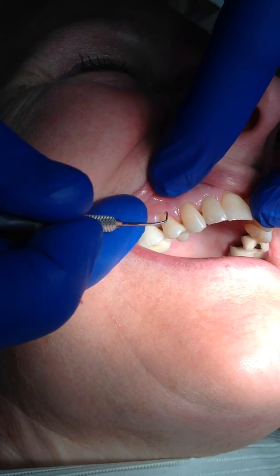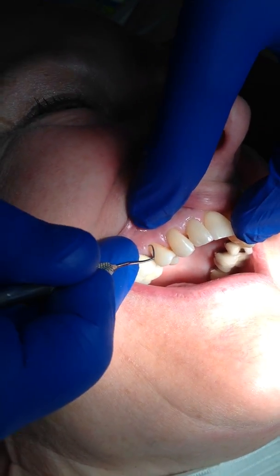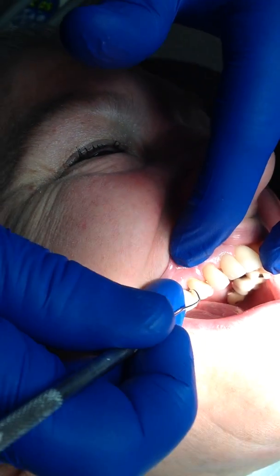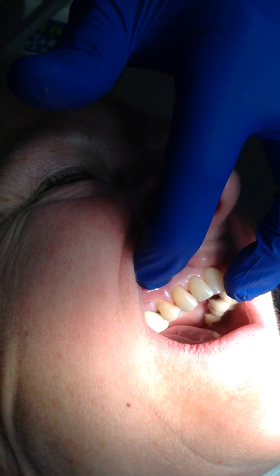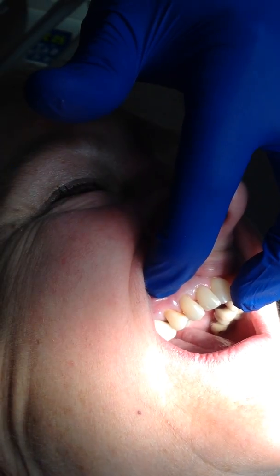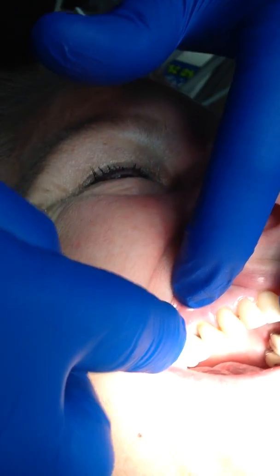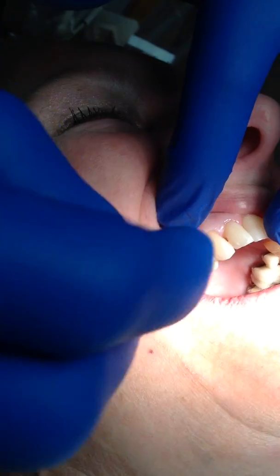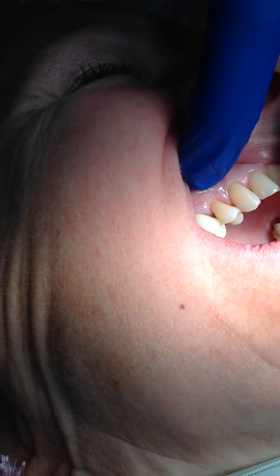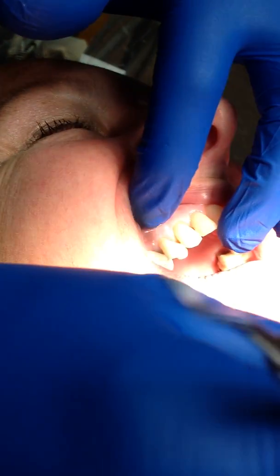One of the first things I do when I do a composite is, before I ever start, I take the composite that I expect I'm going to use, I put it on the area of the tooth, and see whether or not we like the color. It's an awful lot nicer to have the tooth not bonded and find out that you're not happy with the color than finishing the tooth and finding out that you're not happy with the color. So the first thing we're going to do is go ahead and put a little composite on this tooth and see if we picked the right shade.